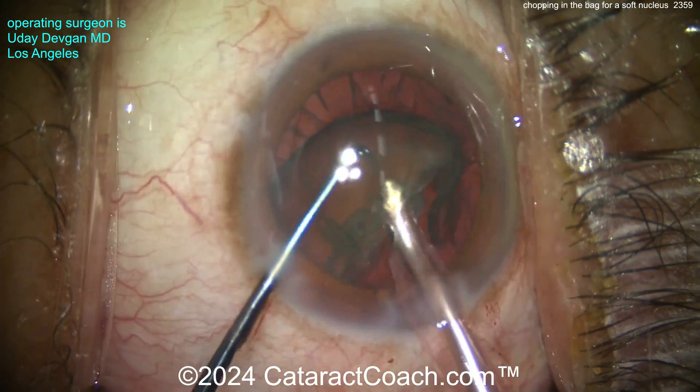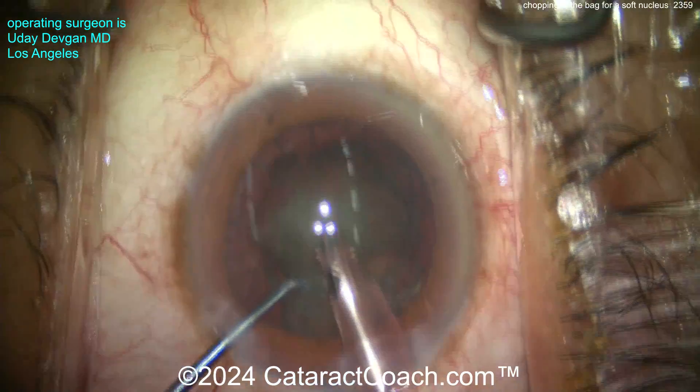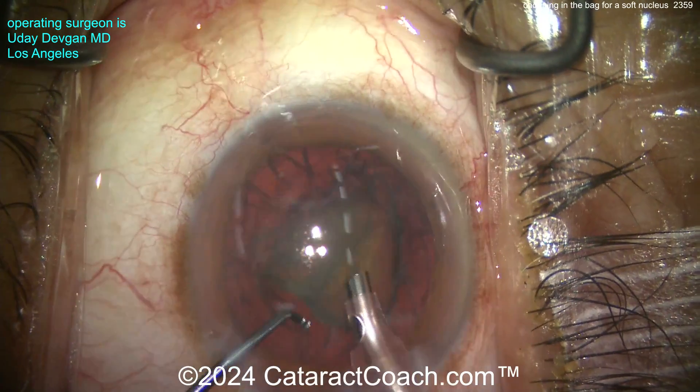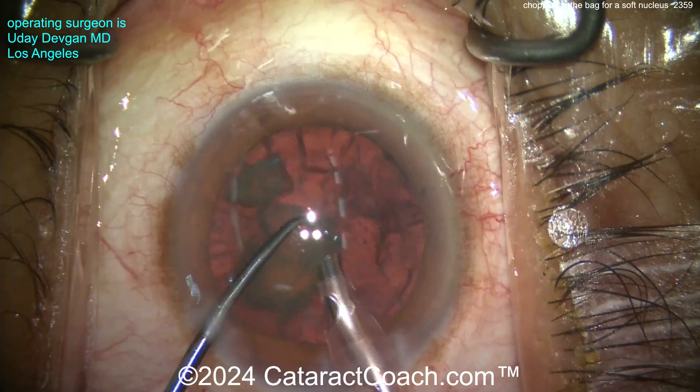It's a pretty soft nucleus and we're able to just emulsify that hemi-nucleus very efficiently — there it is. Here comes the second hemi-nucleus. Bringing it up — if you want, you can further sub-chop it like that, but again it's not a very dense nucleus and you can see we can make short work of this case.